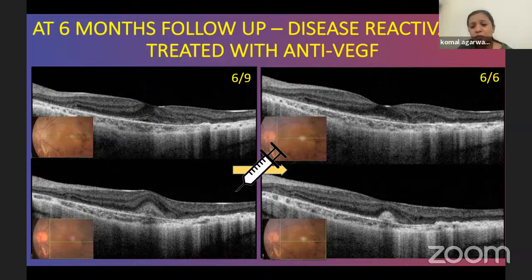Yeah. So just Vishal on that, do you feel, or in your experience, that the kind of CNVMs that we see in BEST or other dystrophies are more classic in nature as compared to occult? And would you feel that would make a difference in how it looks on the OCT, or have more intraretinal changes along with the pocket of that optically empty space?